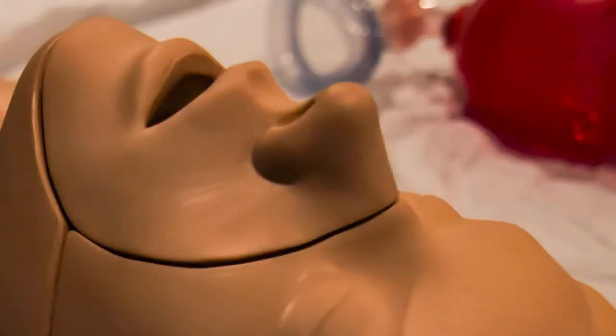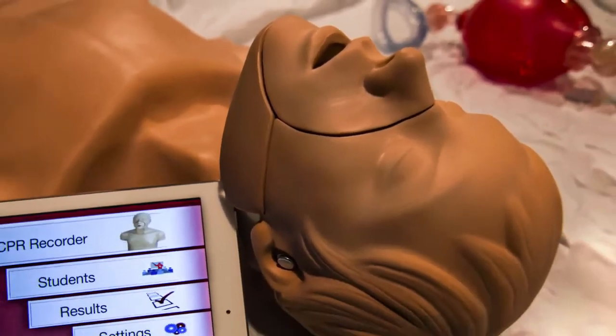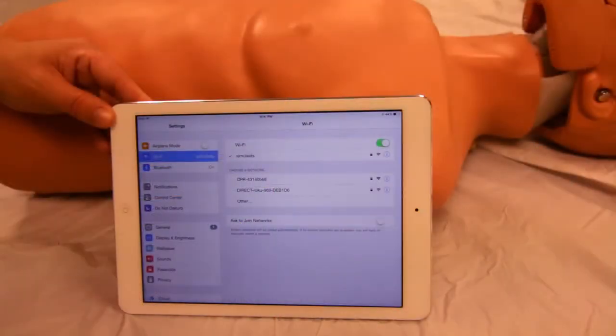Power on the trainer and allow 2-3 minutes for the Wi-Fi to do its diagnostics. To connect the Wi-Fi, go to Settings, then Wi-Fi.